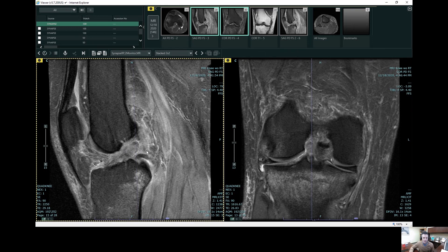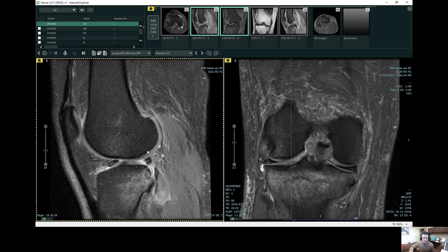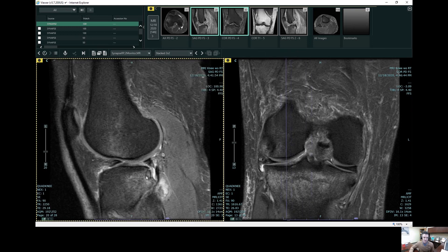The patient also had some additional findings, including an impaction fracture in their posterior lateral tibia plateau. So in the posterior and lateral aspect of the knee, there's an impaction fracture. Interesting case — we see these cases all the time here at AMI.